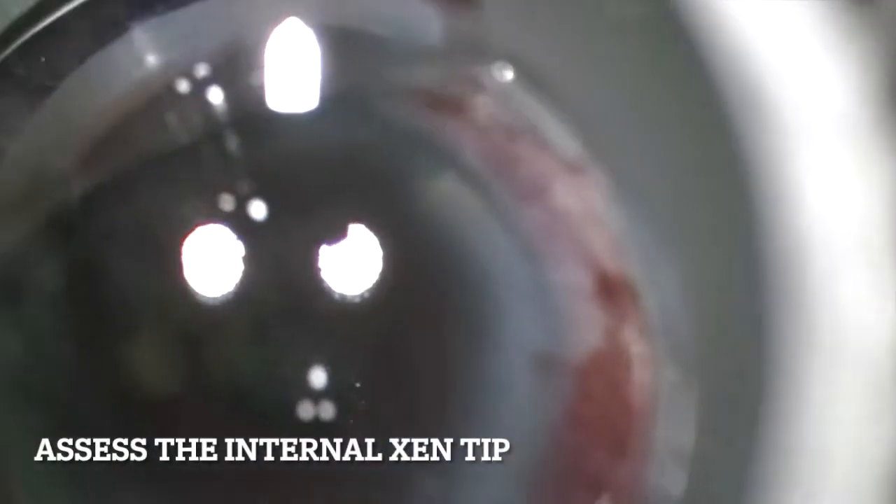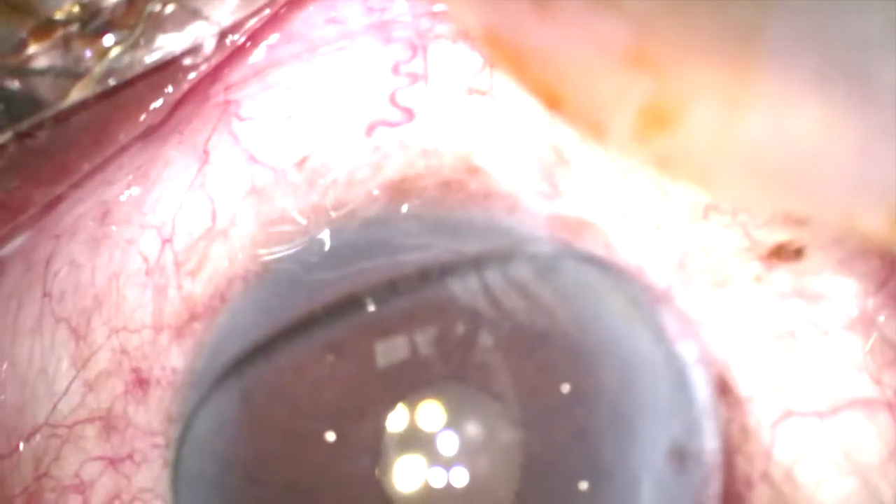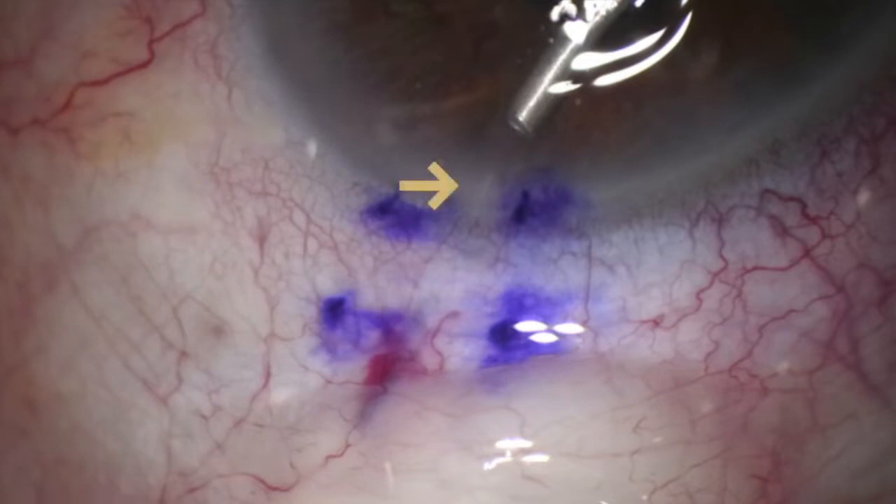After this, it is important to also assess the other tip of the Zen in the AC. You want to see that it is in good position, at least 1mm in length in the AC and away from any other structures like the iris. This can be done with a gonioscopy prism or with a direct view if the tip is easily visible.